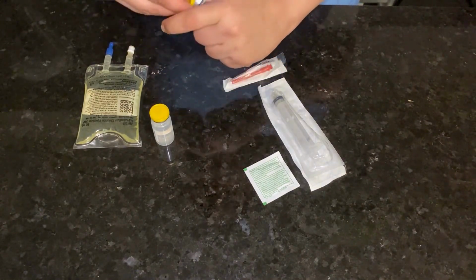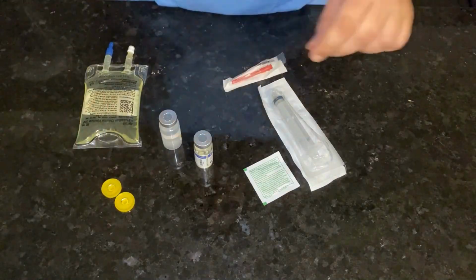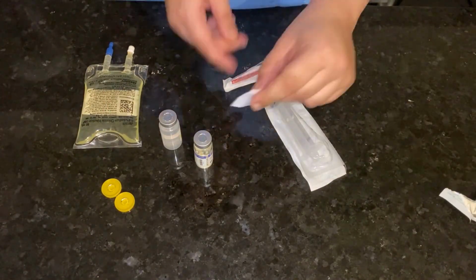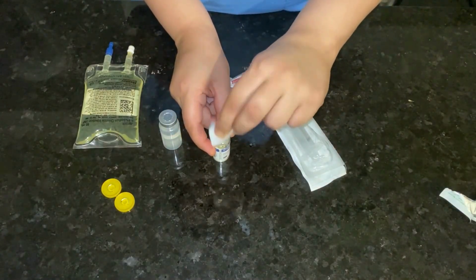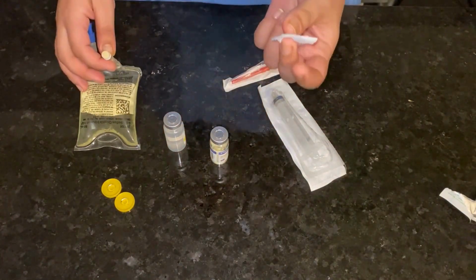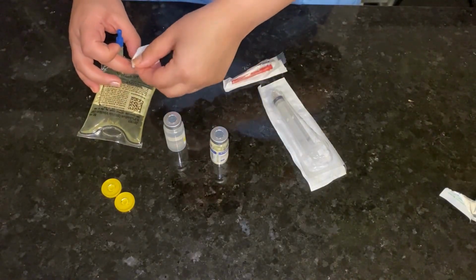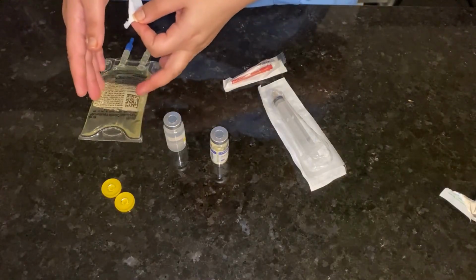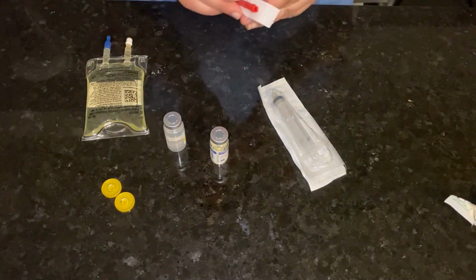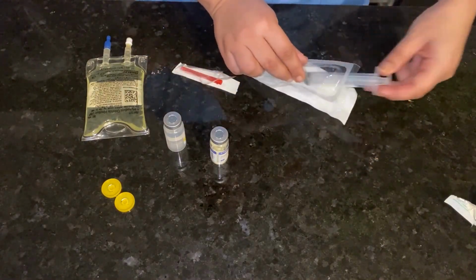Easily open it. Again, open it. Sterilize the top part. We want to be sure that it's completely clean. I don't have an extra pad, so I will also clean this part, the port. Now, for opening this, it should be a banana peeling technique.